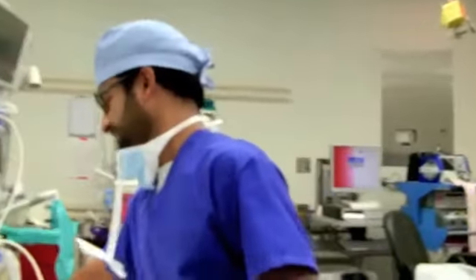Time out. This is patient Joseph Smith. We're going to be performing a spinal anesthetic. The consent has been obtained, and I will now place a pulse oximeter and normal blood pressure cuff on the patient.